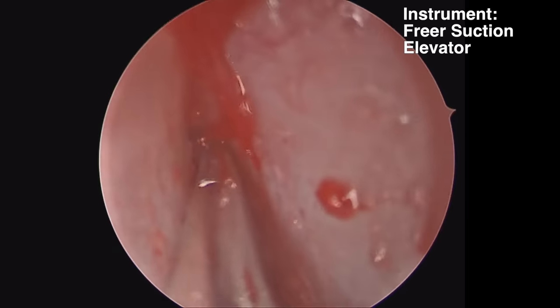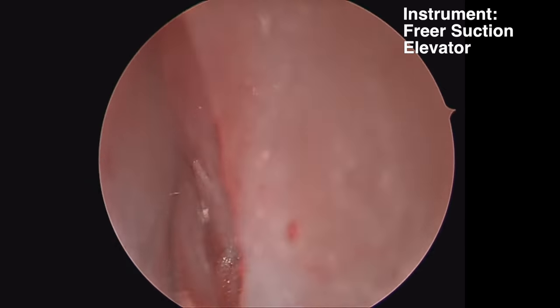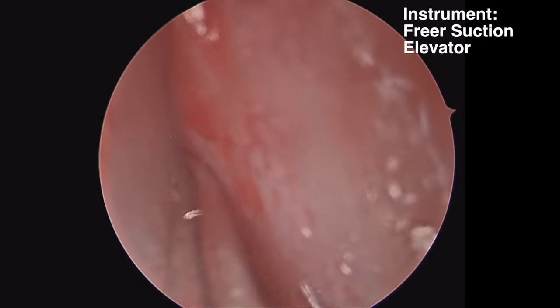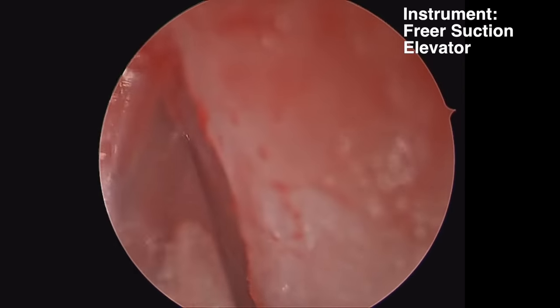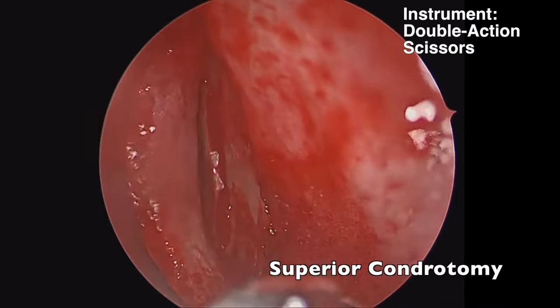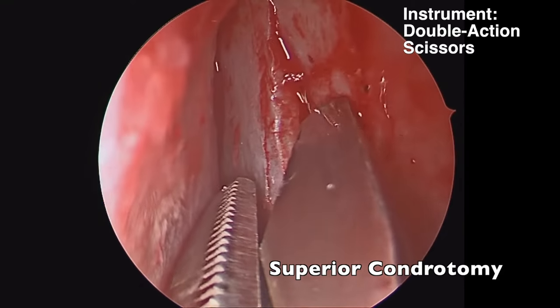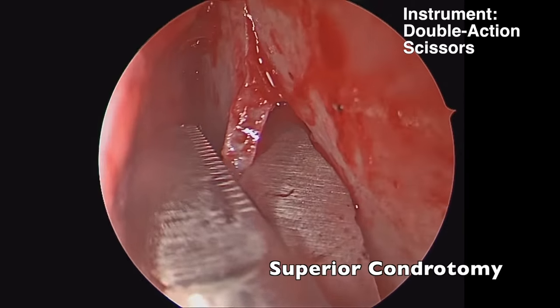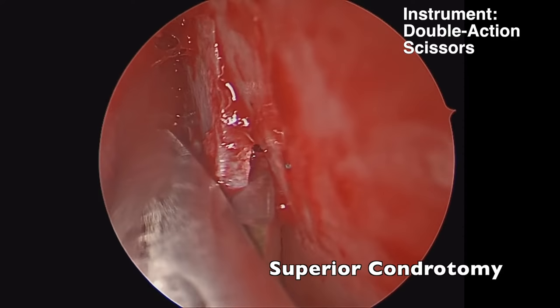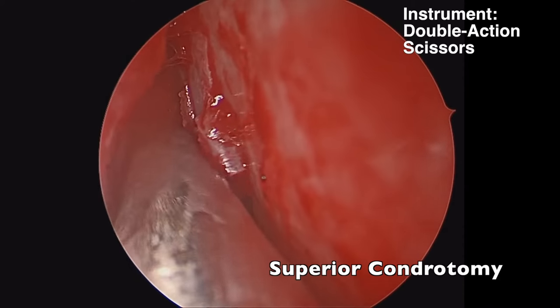We're raising the contralateral flap, and once you have the opposite side freed up, you can start to remove your septal cartilage. We're going to use double-action scissors to make our superior chondrotomy, coming through first the septal cartilage, then extending the cut into the bony-cartilaginous junction and into the bone of the septum.